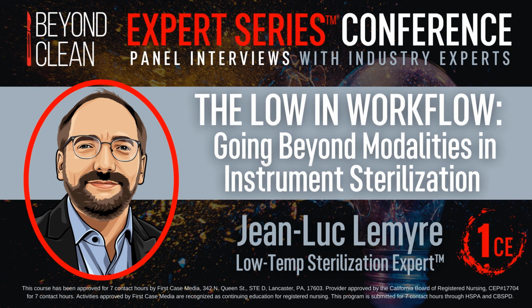So as we think about the industry as a whole, as it stands now, where do you think some of the myths and misconceptions are around hydrogen peroxide, or maybe stated another way, where are we missing the mark with low temp sterilization? Yeah, I think one myth and misconception is that for an SPD to use a sterilizer to sterilize a specific device, the device IFU should contain the sterilizer. When a device manufacturer validates their medical device to get it into the field, they will validate a limited number of reprocessing methods, sterilization or high-level disinfection, and these get into the IFU of the device.